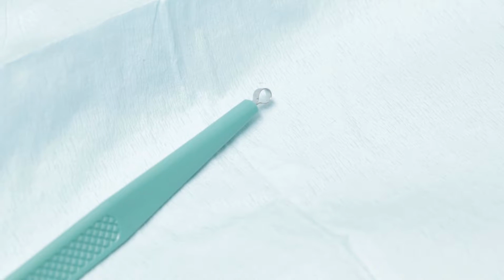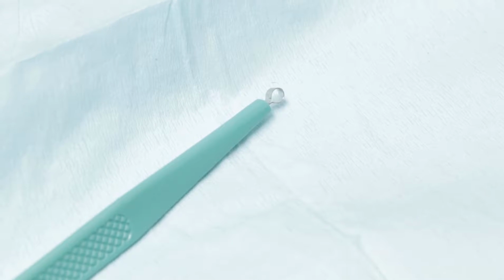You use an instrument called a curette, and you scrape on it fairly firm, and you take off everything that comes off easily with the curette, because the curette really only takes off cancerous tissue, not healthy tissue. Then you cauterize it, then you do it again, then you cauterize it, so you do these 3 passes right after another in succession. This is the instrument, it's called a dermal curette, and it's not super sharp, so it's not going to cut into normal tissue, but it does scrape away the dead tissue.